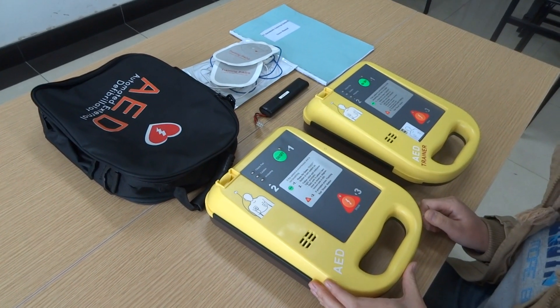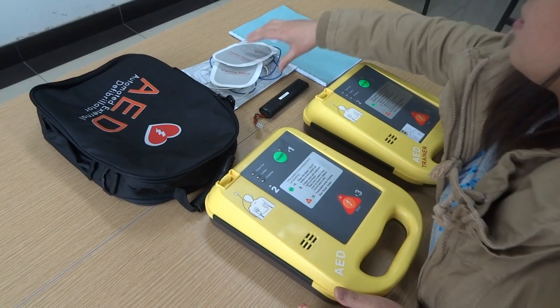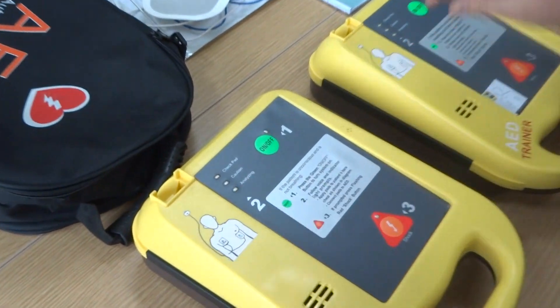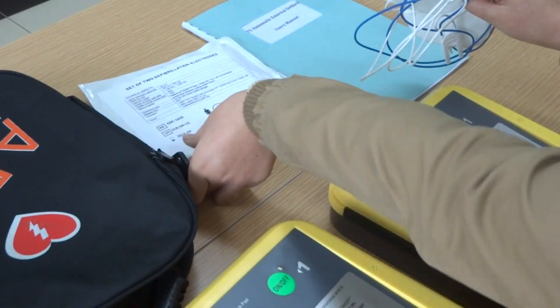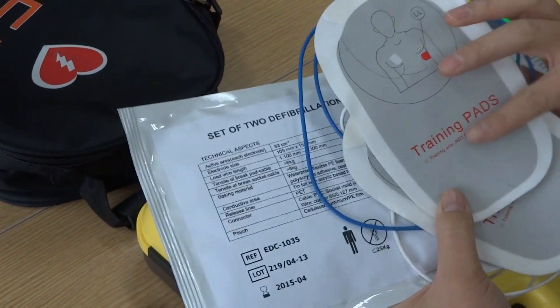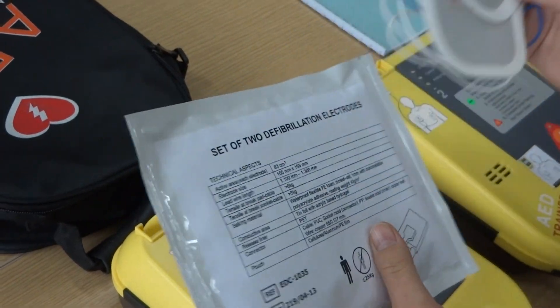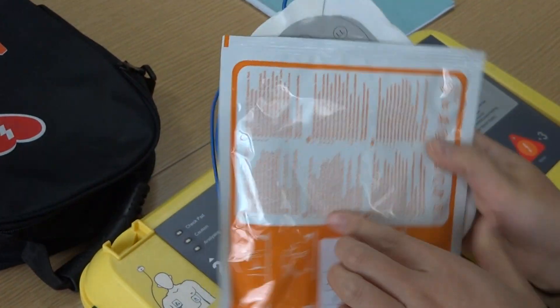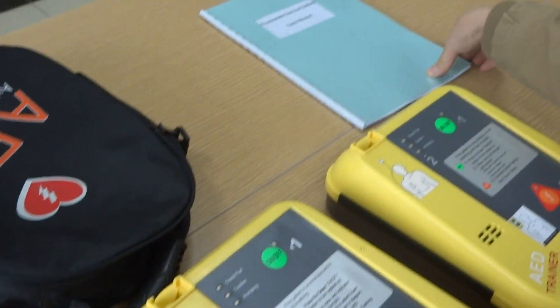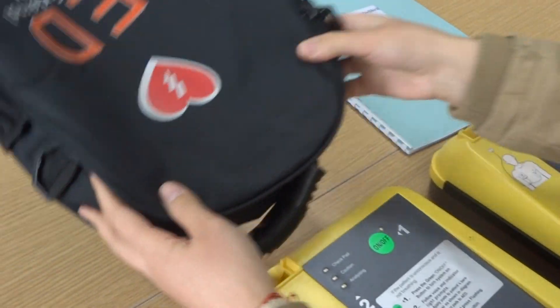First, it's about our accessories and main part introduction. This is a battery. This is the electrode pad — this one has been opened from its package. This is the one inside it; later we will use it to operate. There is also a user manual and one bag.